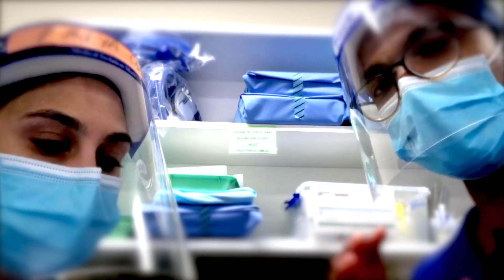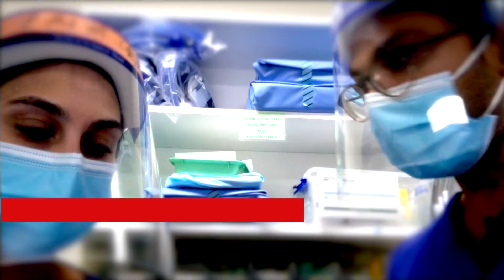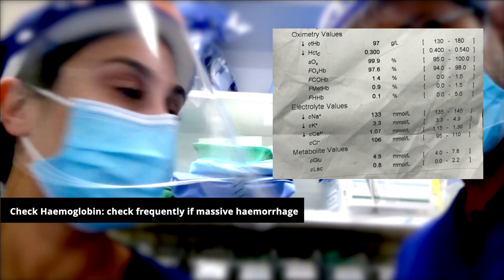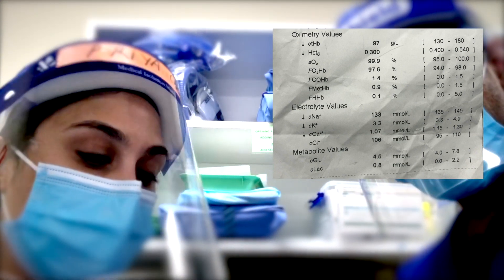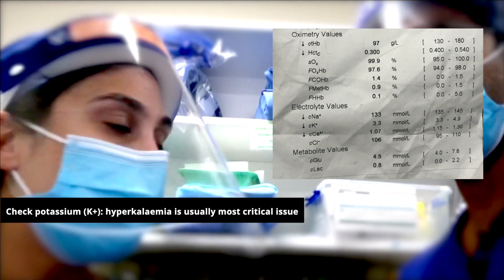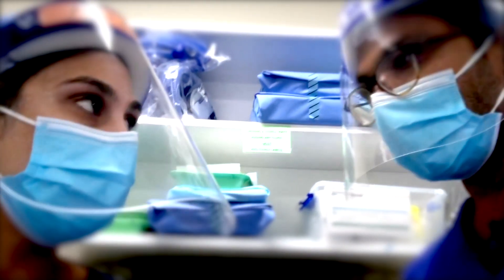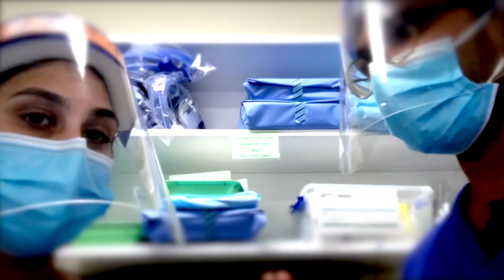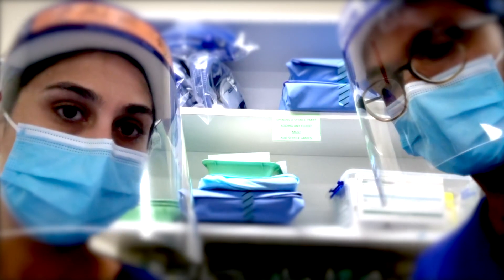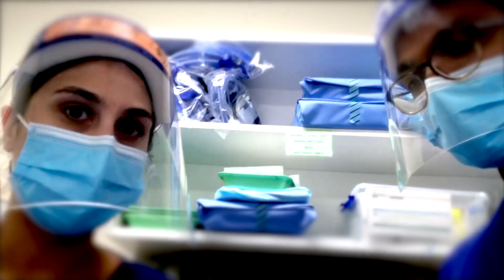Moving on — we're focused on critical, life-threatening findings. Next I look at hemoglobin, especially during surgery, to check it hasn't acutely dropped, which could cause lactic acidosis from hypovolemia or bleeding. Then I look at potassium, specifically for hyperkalemia, which is life-threatening. In anesthesia, we often give suxamethonium, which can raise potassium by 0.5 to 1 mmol/L — even more in burns, critical care myopathy, or other myopathy patients. A potassium above 5.5 is concerning.